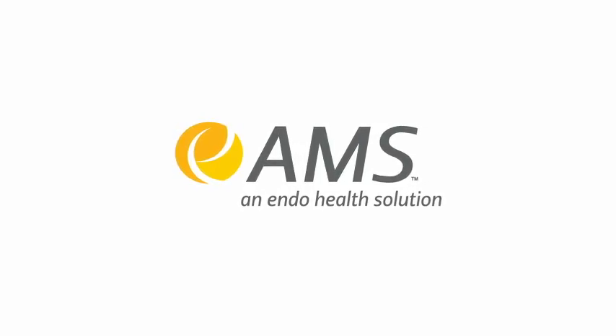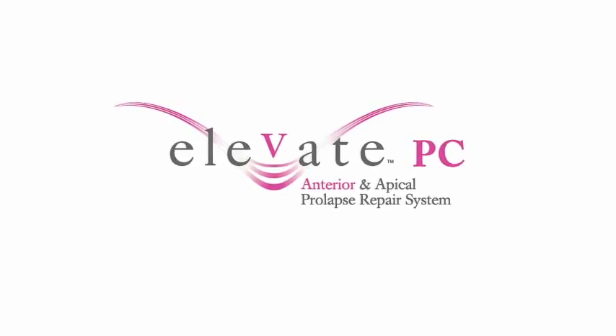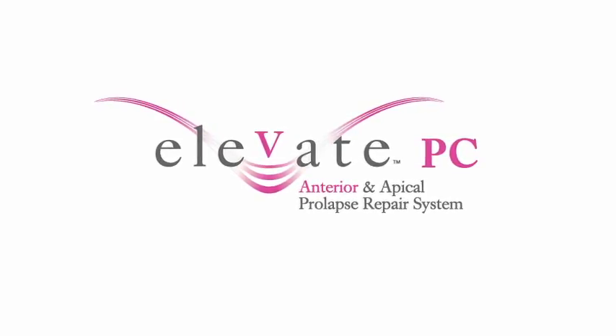American Medical Systems presents the Elevate PC Anterior and Apical Prolapse Repair System.